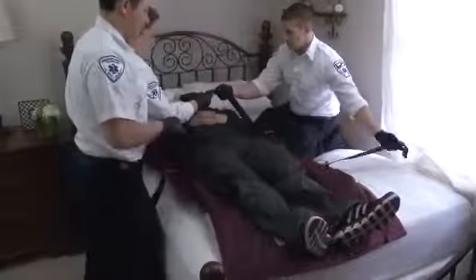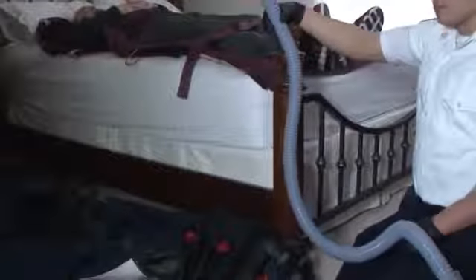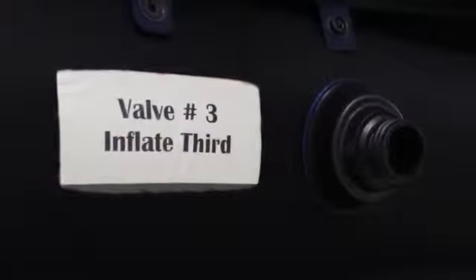Buckle the patient's safety straps, ensuring that they remain loose as they will tighten around the patient when the HoverMatt is inflated. Bring the deflated Evacuation HoverJack 2 next to the patient's bed and release all buckles. Ensure that the red deflation valves are capped and that the self-sealing black inflation valves are uncapped and easily accessible.